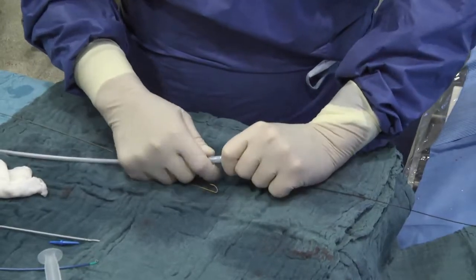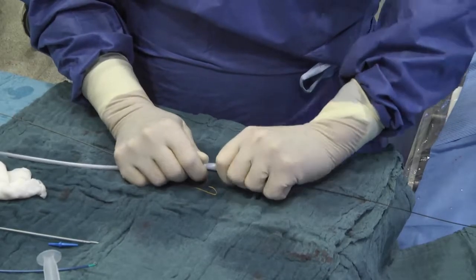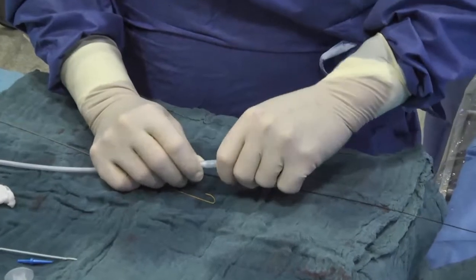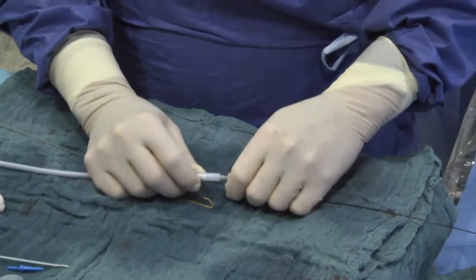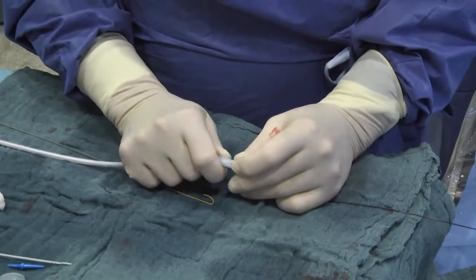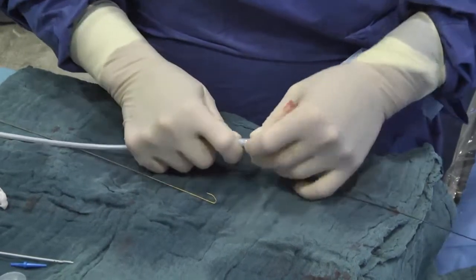Mark? Yes? Can you comment? Sure. Hello, this is Andreas Eichen. Andreas, good morning. Mark, we use a PowerFlex balloon for this widening, a 10 millimeter PowerFlex balloon, just to make the comment. So you balloon dilate the tip of the sheath, the covering, to expand it. Yeah.